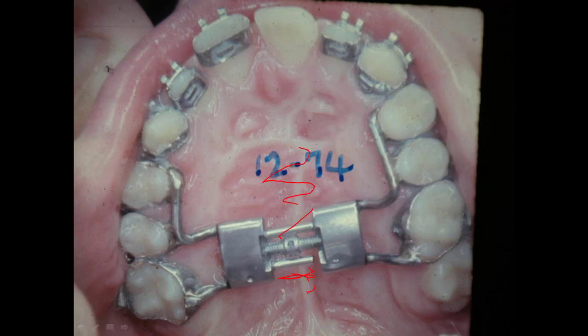The bone filled back in the palate and was quite stable after we finished the separation. Now we banded all of these teeth. We made our own separators. I could see this one was coming apart right in here, so we had to change it, put another one in there, and then cracked it a little bit further.